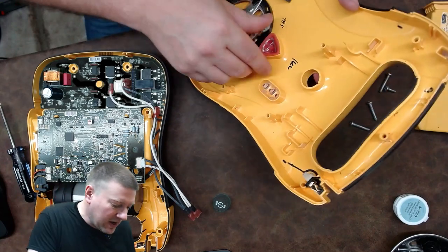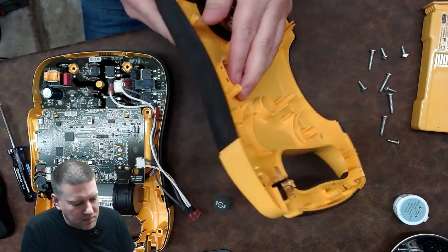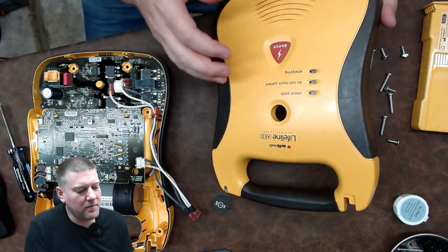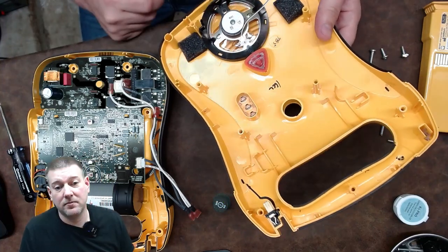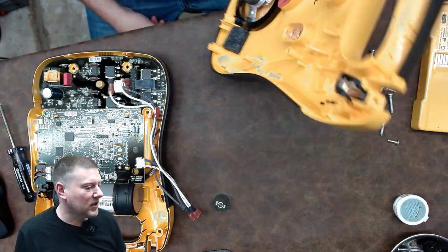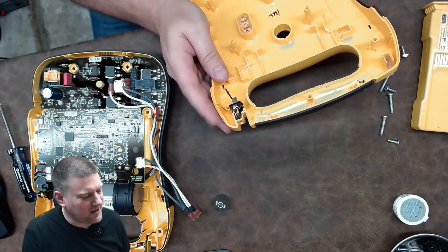In the lid we have your main activation button and some light rods that carry light from the LEDs on the board to the front panel — very cool. We also have a speaker, which appears to be weatherproof — a nice feature since you never know what environment these will be used in. And this is your pads interface, not the battery.